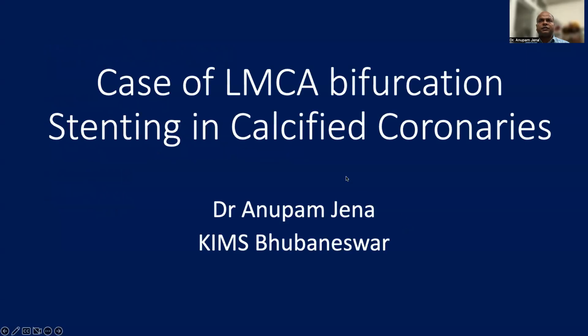This presentation is for my interventional cardiology friends. Here I'll talk about a case. I'll show one case of intravascular lithotripsy followed by bifurcation stenting with the use of the double kissing crush technique. Let me present my case and then we'll discuss these things.